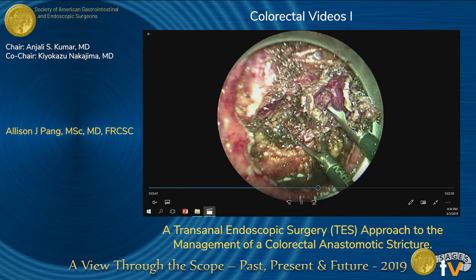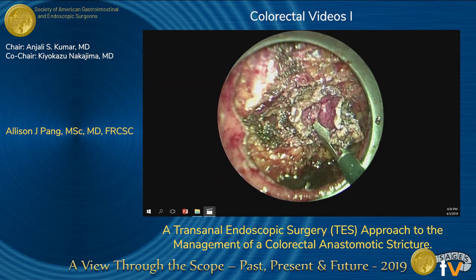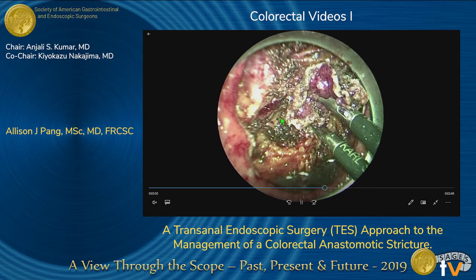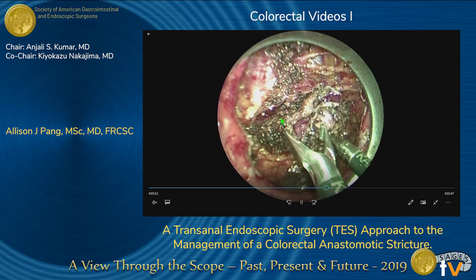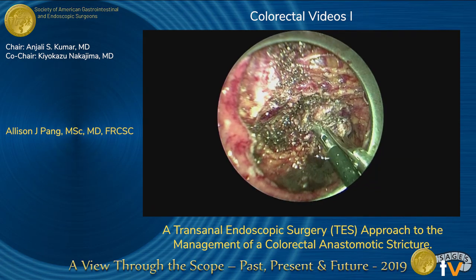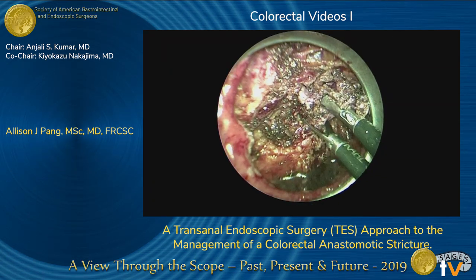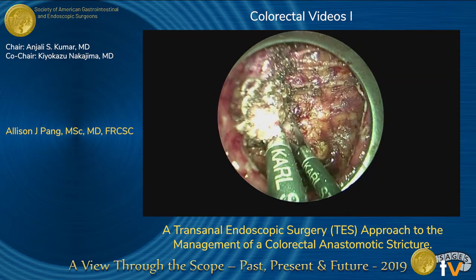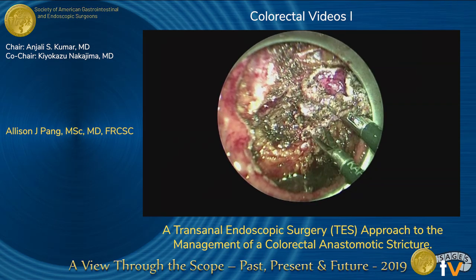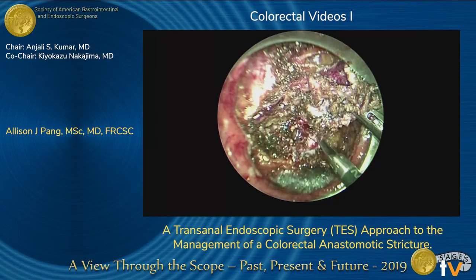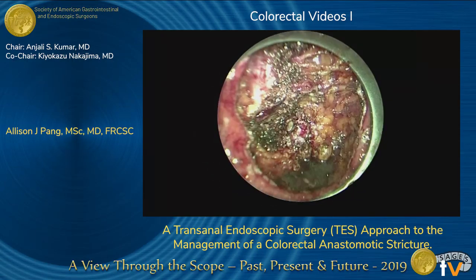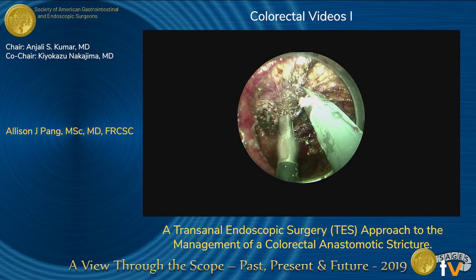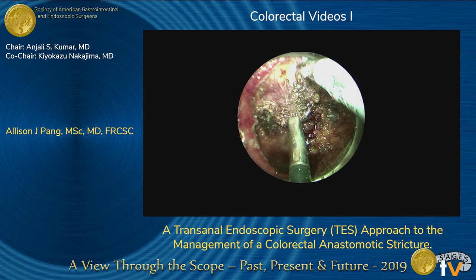One of the challenges of the procedure was understanding when we had reached proximal to the stricture. If I can bring your attention to these holes right here — we are actually looking into the lumen of the proximal bowel. At this point we have made our transection distal to the stricture and are now beginning our transection proximal to the stricture. We used Metzenbaum scissors here since cautery was sparking off of the nearby staples. We are finishing off the resection, including a leftover staple line. Once the stricture was completely resected, it was sent off to pathology.